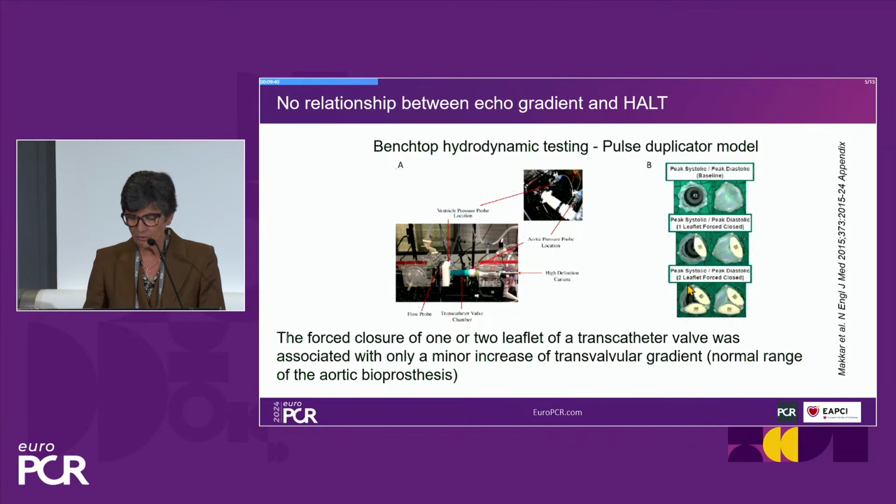You can see on the right part of the slide how we can use a forced closure of one and even two leaflets of a transcatheter valve, and it is not strictly associated with a high increase of transvalvular gradient.